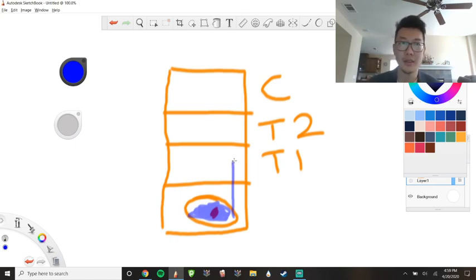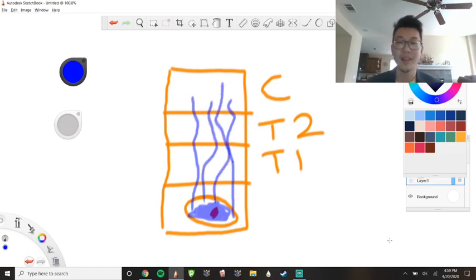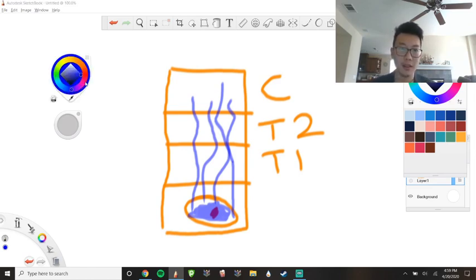So when it touches certain materials, it's actually going to move along those materials if it's a certain shape. So this whole thing moves up, spreads through there. That's water, by the way. That's our goal. So what each of these stand for is, let's change colors again.